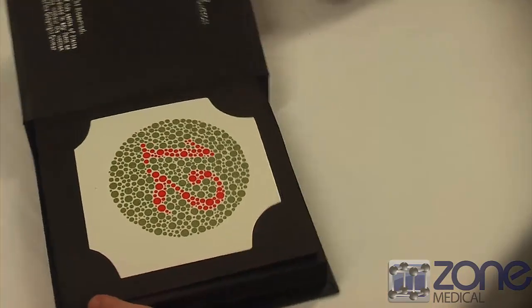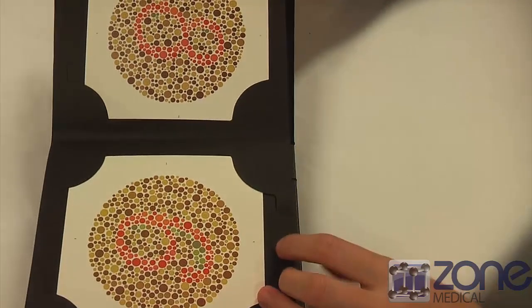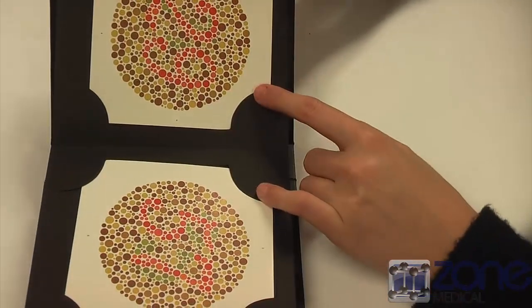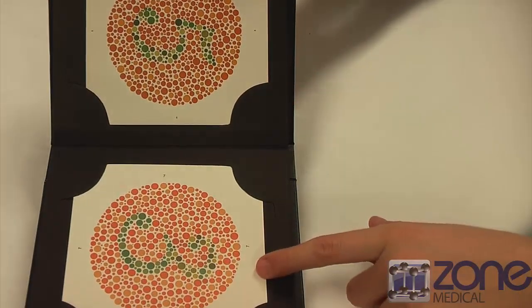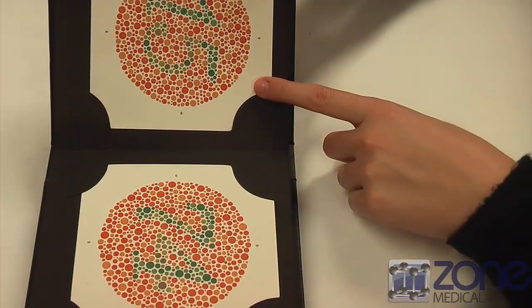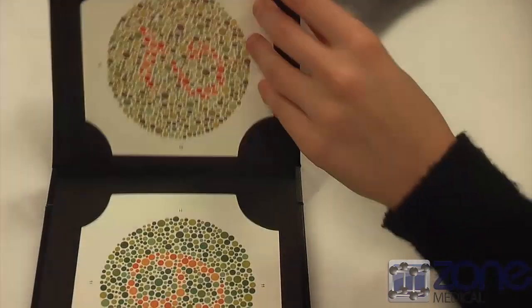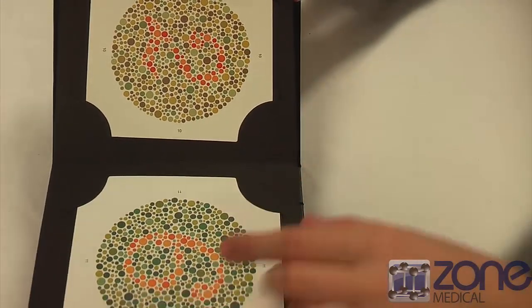Can you please tell me what number this is? 12. This number here? 8. This one here? 28. 57. 5. 8. 15. 94. 8. 6.